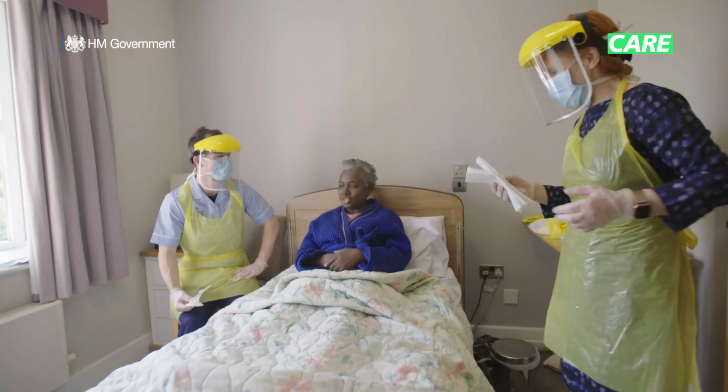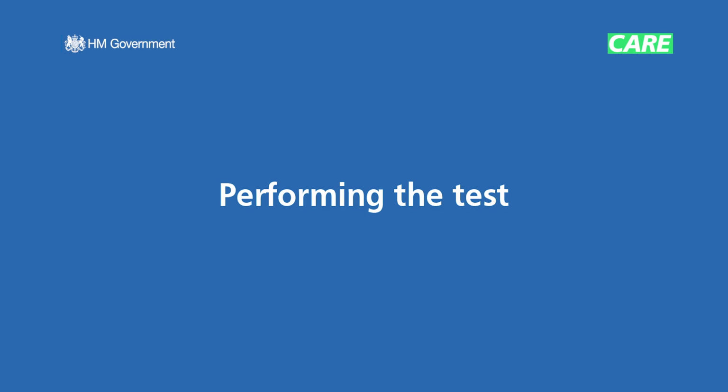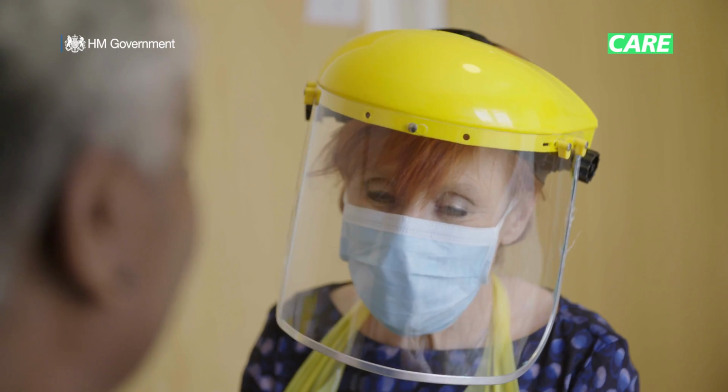If at any point the resident becomes distressed, follow your local guidelines and abandon the test. As always, do follow your local guidance about consent, including what to do if someone doesn't have capacity. Check if they've had any recent nasal surgery, abnormalities of the nasal passages, or have cuts or any other injury that would make swabbing of the nose difficult.